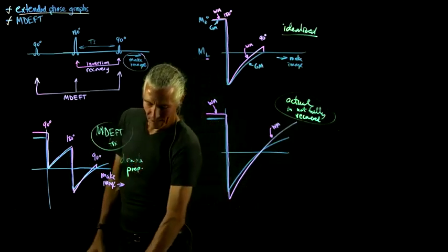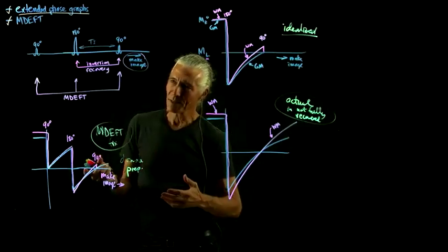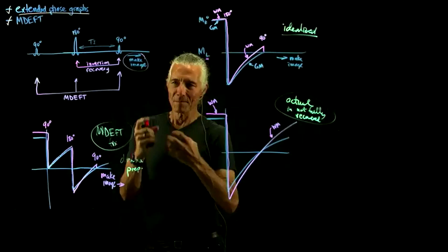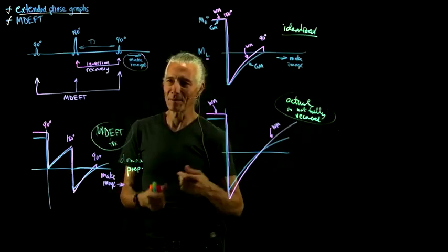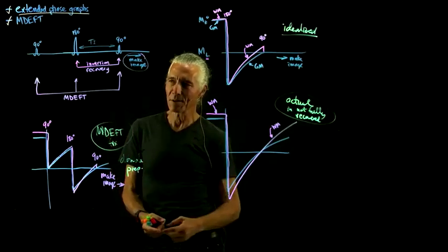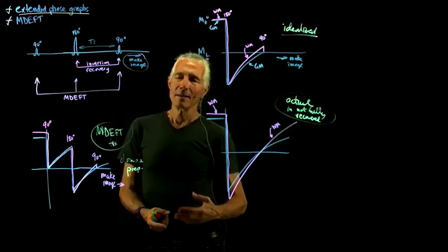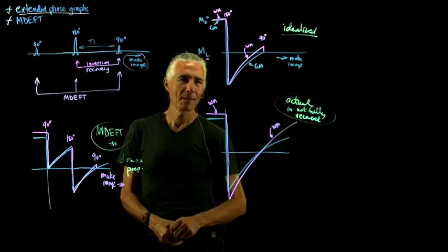And the thing about this is again, you can adjust these things. If you have an MDEFT sequence on the scanner, you can adjust all these numbers, but if you don't have some feeling for what they're doing, you're just totally guessing, just sort of experimenting around. And so once you've collapsed this to a single equation, then you could easily see, for a given T1 value, what would be the optimal timing for these various things.